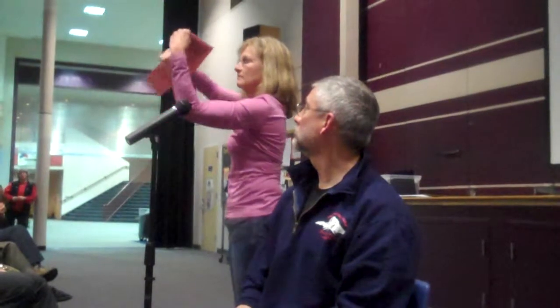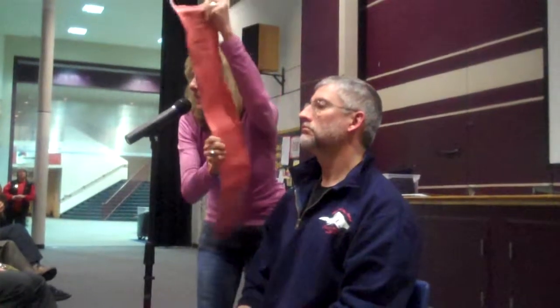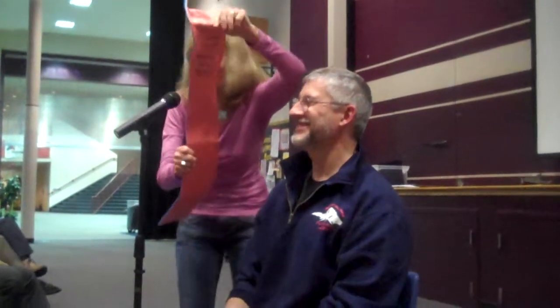I am going to now bend the top edges back to make a shelf for his jaw. Notice that this is just going to go right on his chin — it doesn't go underneath his chin, and it doesn't go up and over his chin. It goes right underneath his jaw to provide that nice support.